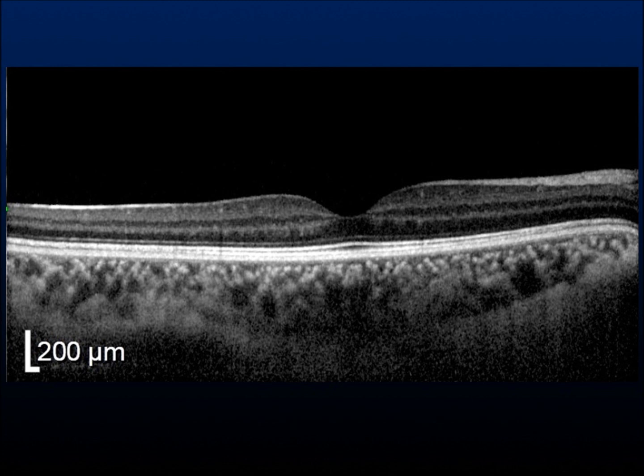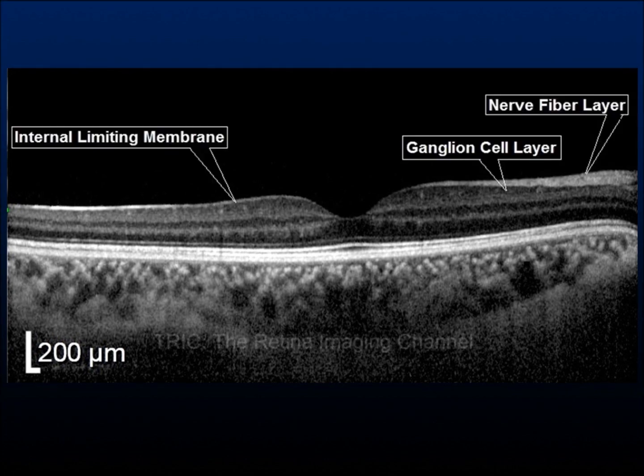Starting from the vitreous side, the first or innermost layer of the retina is the acellular internal limiting membrane. It is followed by the nerve fiber layer, which is particularly thick near the optic nerve head. If you want to know which is the nasal retina and the optic nerve is not provided in the OCT image, the nasal retina is where the nerve fiber layer is more prominent or thicker. Next is the ganglion cell layer, which is a narrow hyperreflective band after the nerve fiber layer.